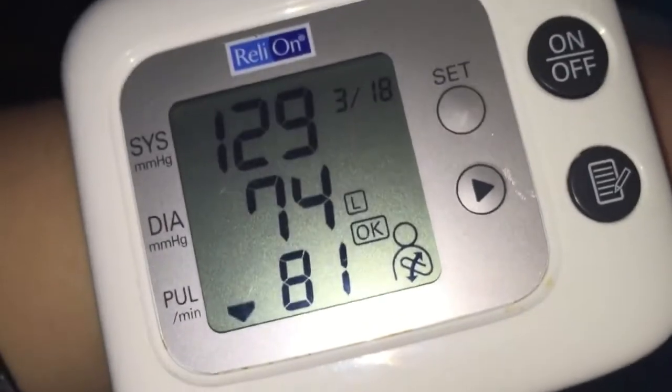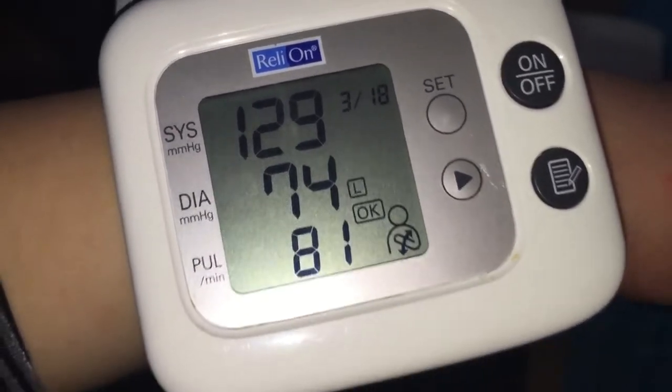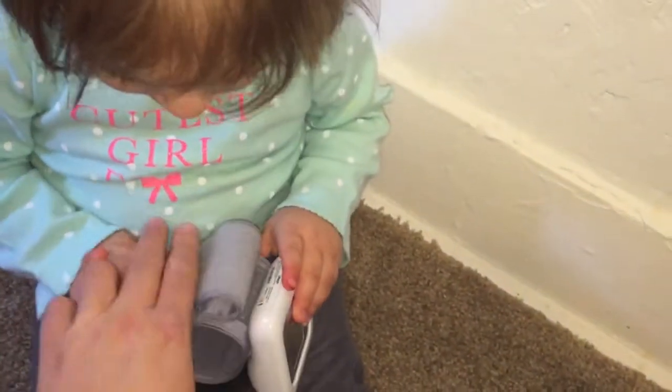Okay, that is a good reading. The RelyOn shows 129 over 74, pulse 81 — which for me is actually really good. Okay, let's try the Omron now.